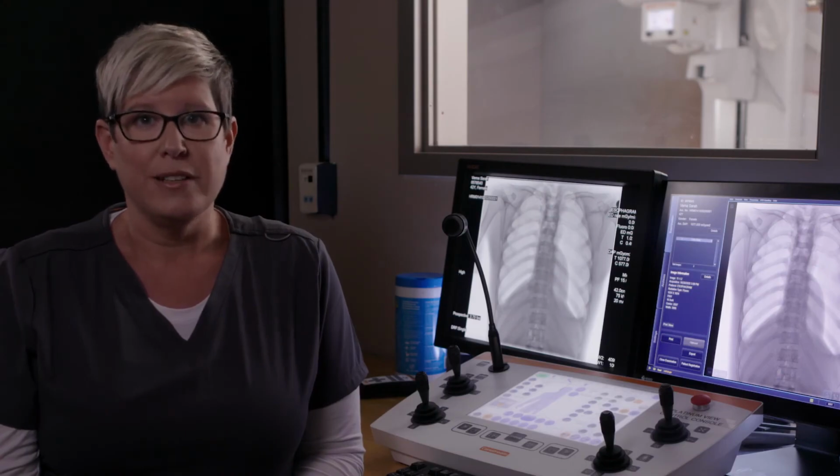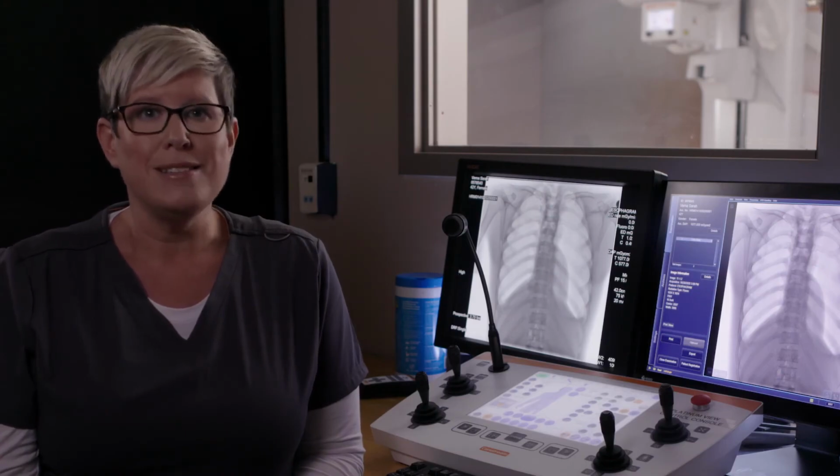From the work list, you can select from the current work list or manually enter a new patient. There's also a trauma button, allowing you to image immediately without entering in patient information. For timed studies, you can suspend an exam from the image acquisition screen. Suspended exams can be easily accessed from the main work list screen.